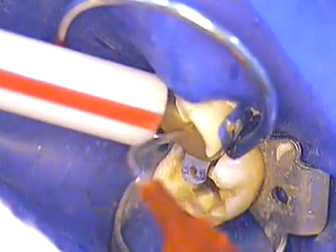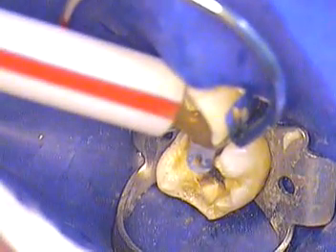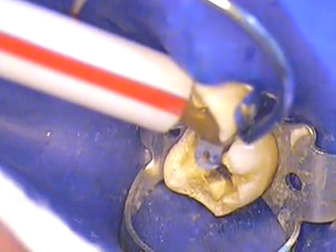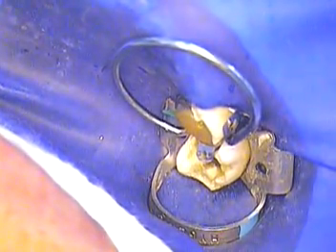Get rid of all that and just blend that layer down. We're going to cure that with our light — I'm using the Demetron 401. She just asked me to mix the core paste and I said go ahead and mix the core paste. What we'll do later on is possibly use another type of camera from the outside so you can actually see how she mixes that core paste — I'll try to put that in my upcoming video.